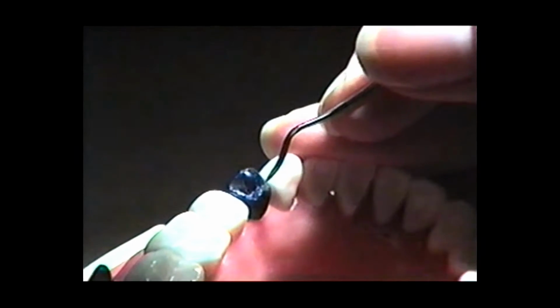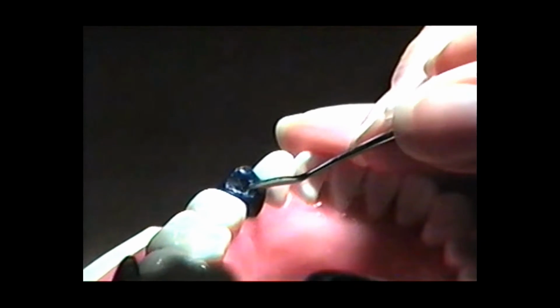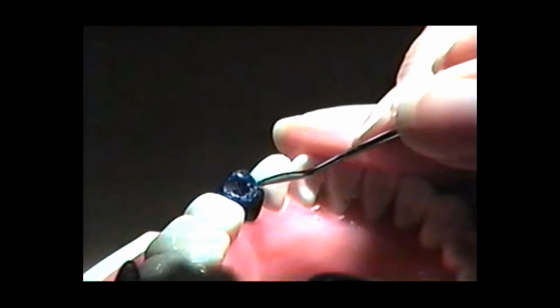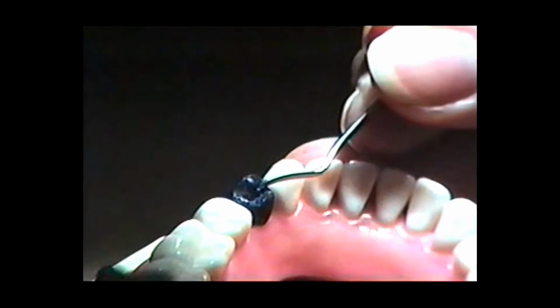Okay, one more minute on this carving of the occlusal, and then I'll show you how to check with the powder and see where we're at for contacts and how to get the contact exactly where you want it on the tooth.